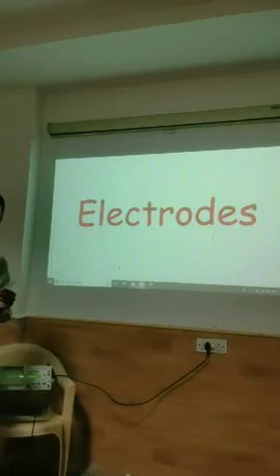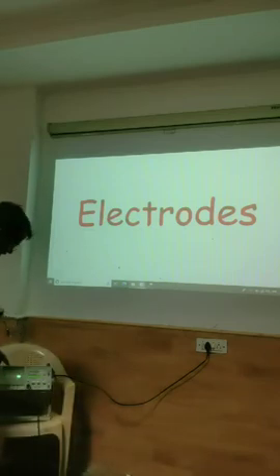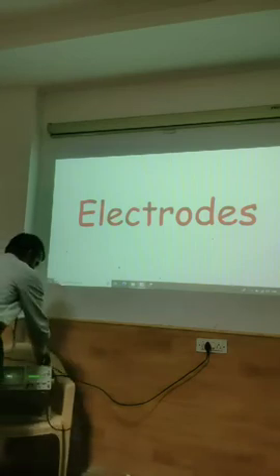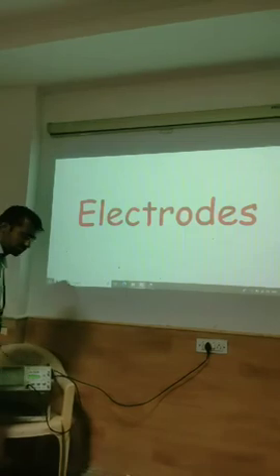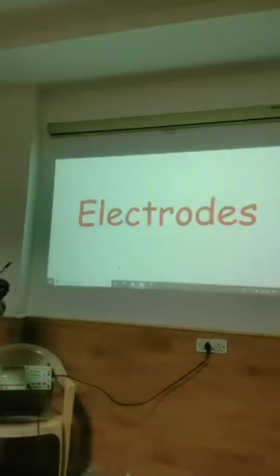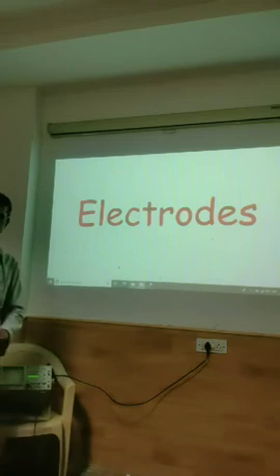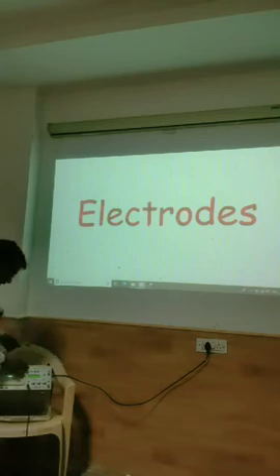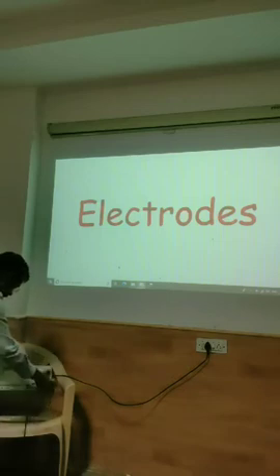Now if I pose a question about where this signal came from, previously you would have thought that it is from the surroundings or noise. If so, then the wire is an antenna, right? For example, in FM radios, a wire is considered an antenna. It should have picked up signals then, but it is not picking up, whereas now it does. So this makes the difference. The signal has come from our own body, or it has been picked up from my body.